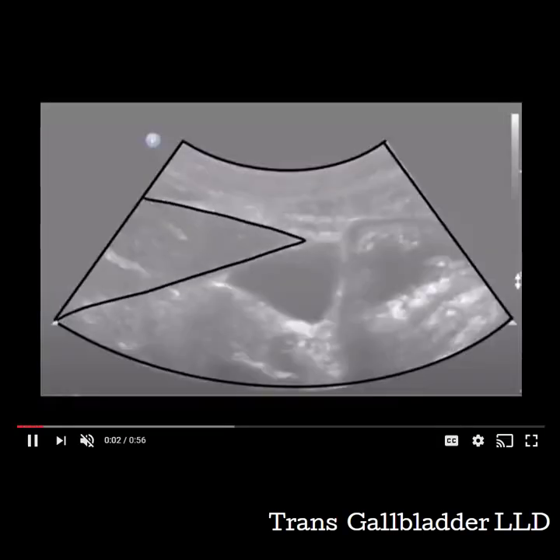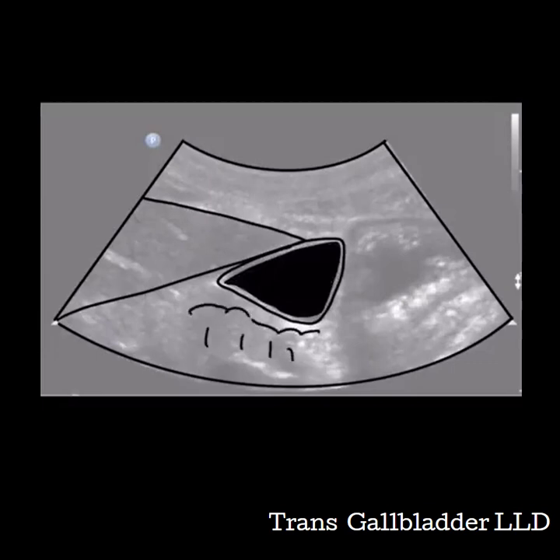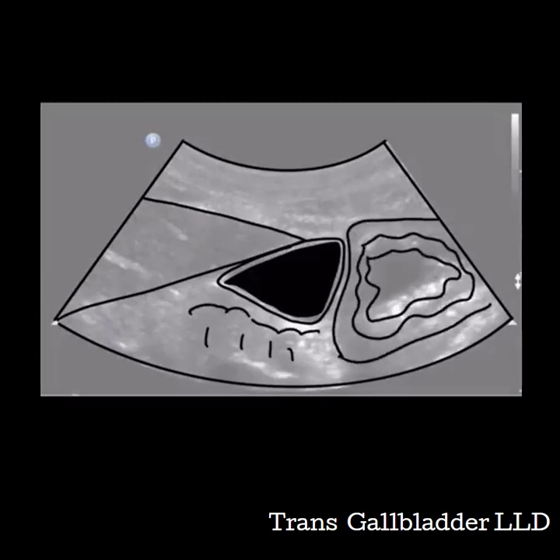Turning the transducer 90 degrees from the longitudinal image will help to get you into the correct position for the transverse plane. This can kind of be a tricky image to clear of artifact because the gallbladder is usually surrounded by more bowel and the stomach. To measure, find an area on the anterior wall that is adjacent to the liver. The liver offers an excellent acoustic window to see the detail of the gallbladder wall.